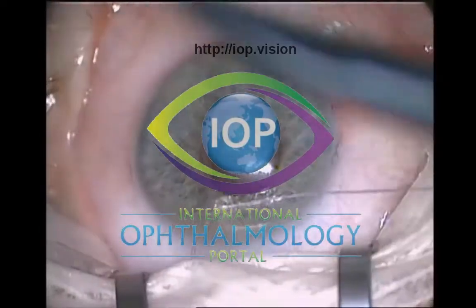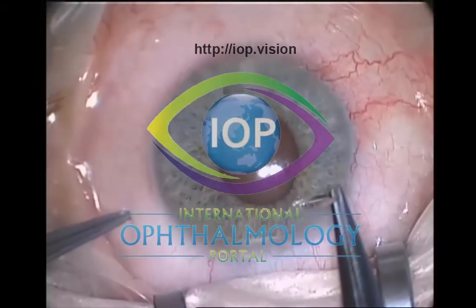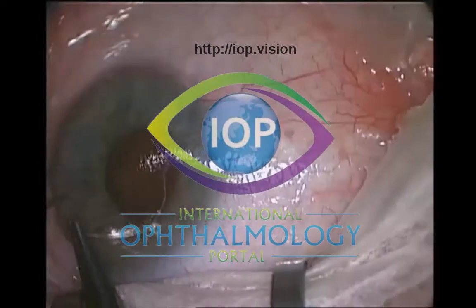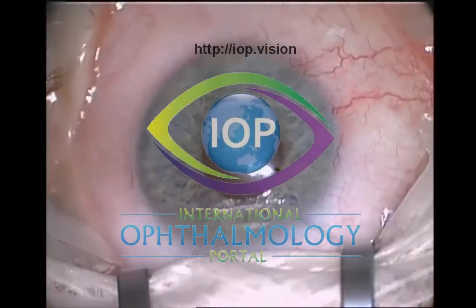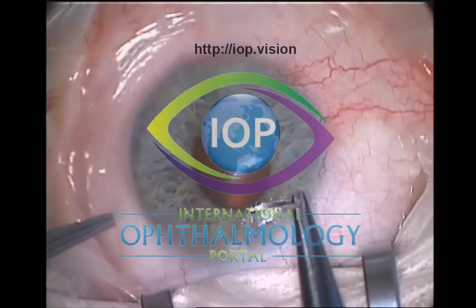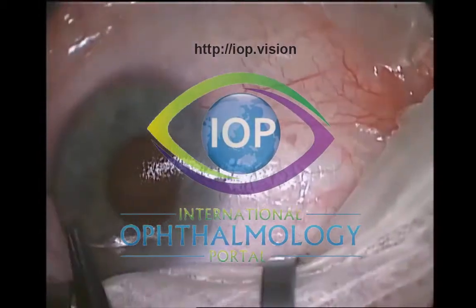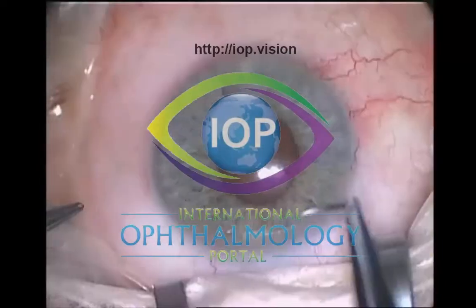I think very much so. A couple of very important things you've said there - I use a 7-0 black silk on a spatulated needle, because the spatulated component stops you from going too deep and perforating. Like yourself, for most of glaucoma surgery, the needle is actually held at approximately the halfway point of the needle - not the traditional way you hold a needle for suturing, for example when suturing an extracapsular cataract wound. I always keep the cornea bone dry at the point at which I put the corneal traction suture in, so that you get rapid engagement.